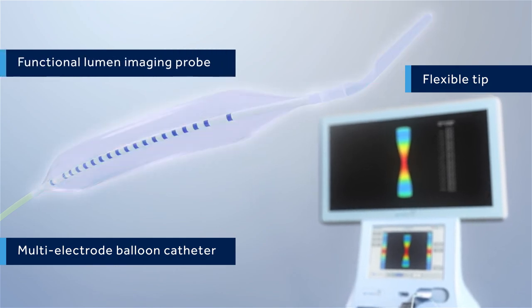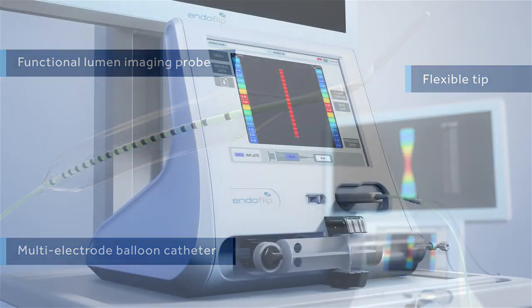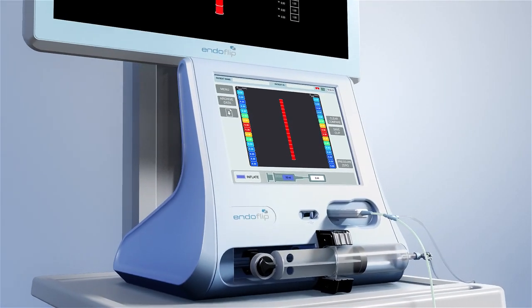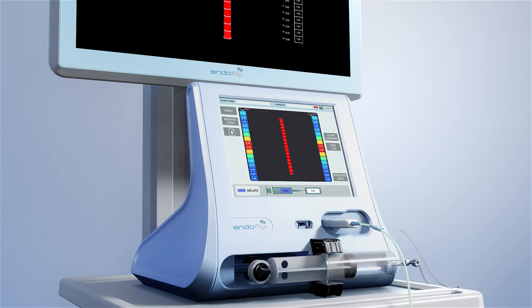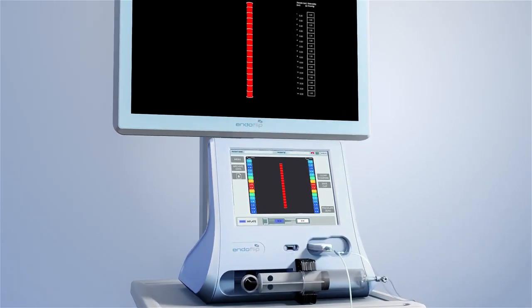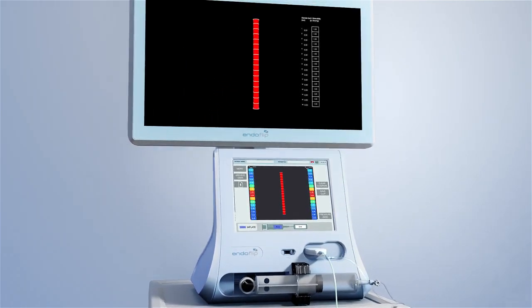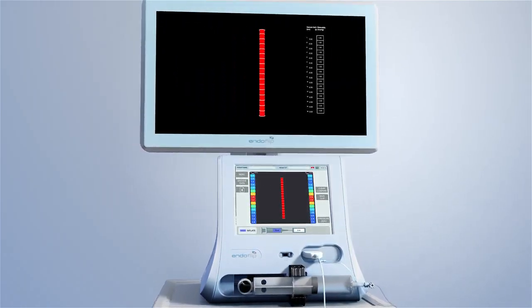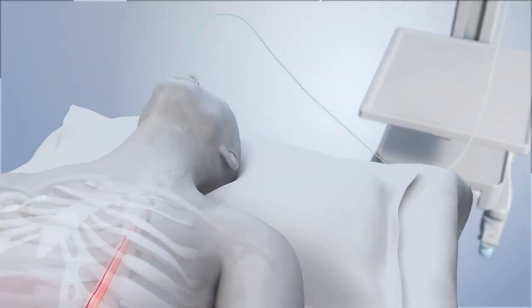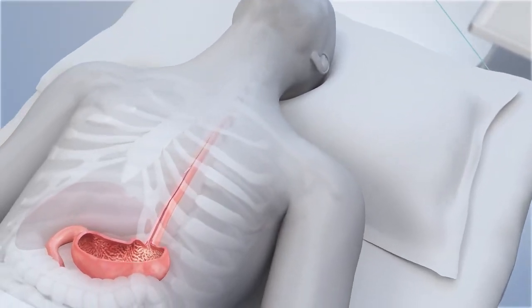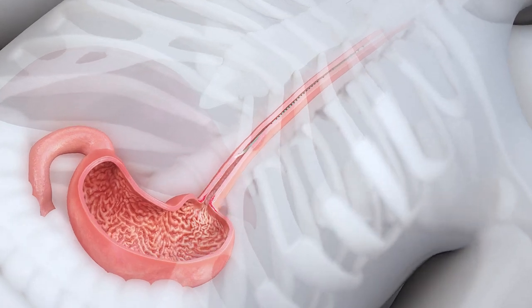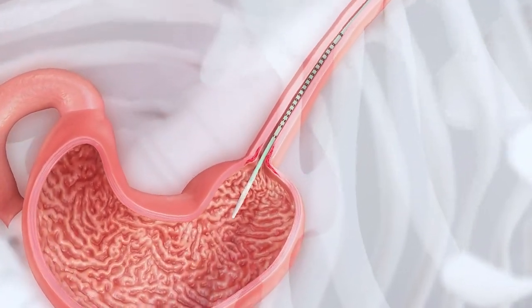The system also introduces imaging software that displays esophageal topography output and dimensional changes on a 24-inch touchscreen. First, the probe is placed transorally through the gastroesophageal junction.